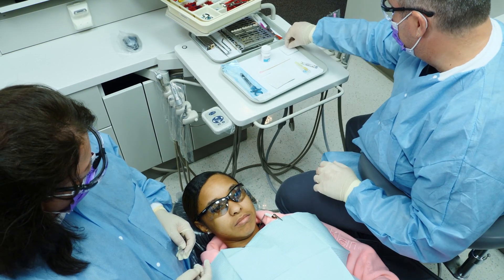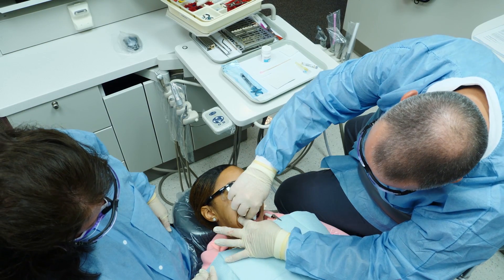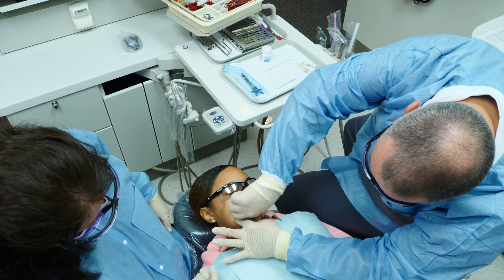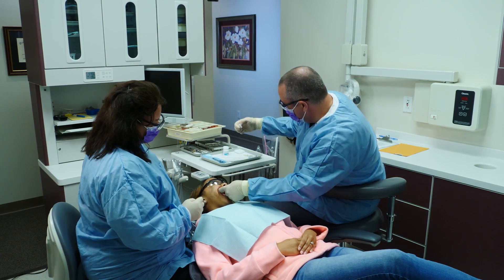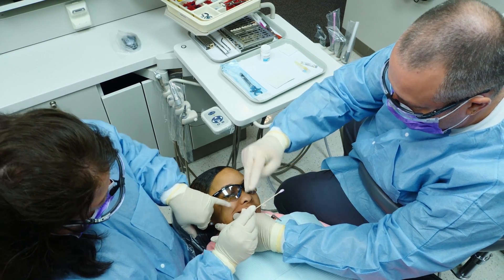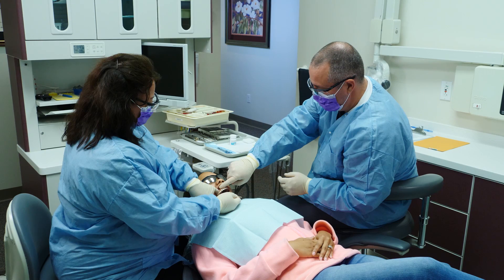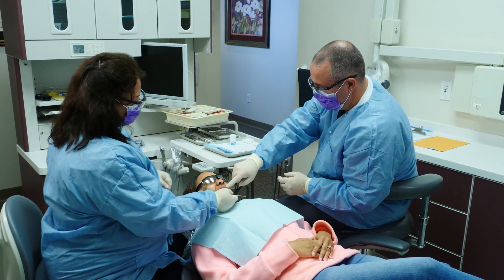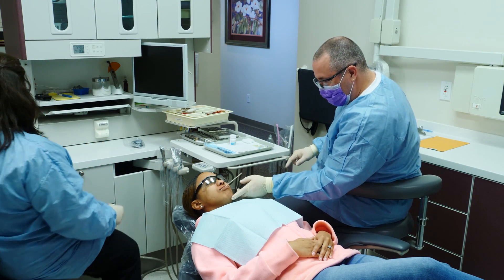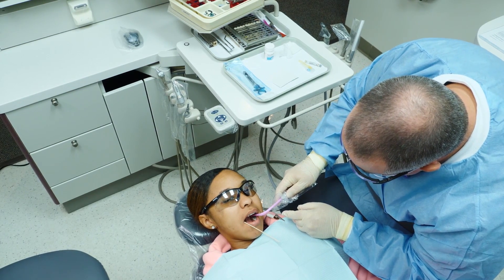The procedural steps to apply topical anesthetic include: explain the anesthetic administration procedure, carefully dry the site with two-by-two gauze squares, pass the applicator with the anesthetic on it to the dentist with the stick end facing the dentist for them to apply the topical anesthetic. Assess the patient while the applicator remains on the injection site for approximately three to five minutes. Always provide suction as necessary for patient comfort.